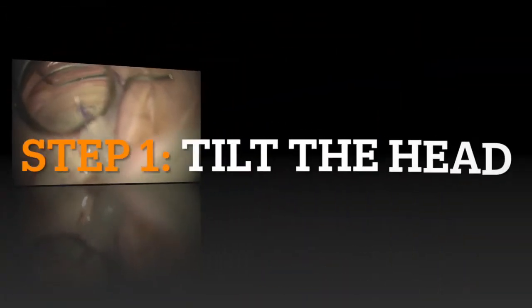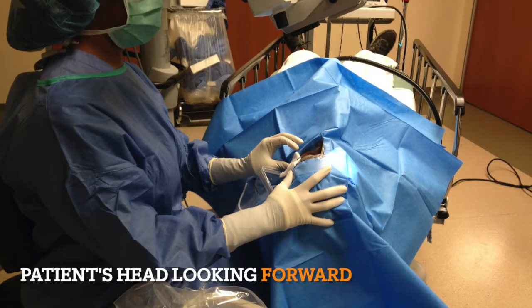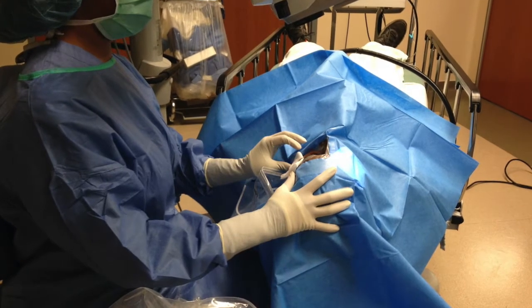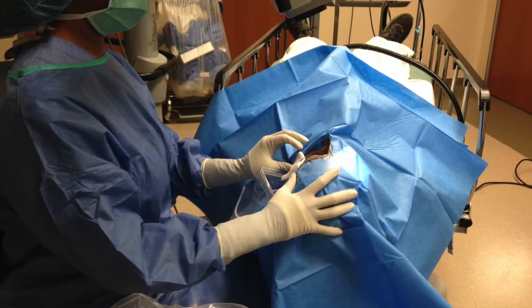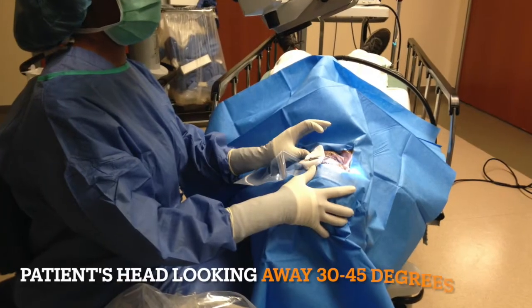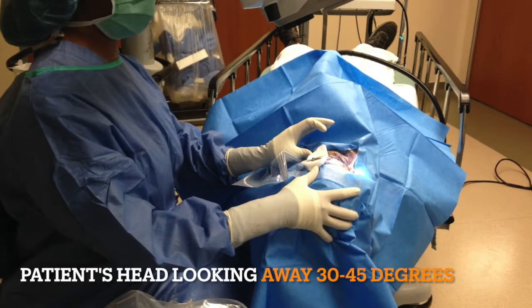The first step is tilting of the head. This may appear to be a simple step, but is very important to obtain a great view. Typically for angle surgery, we sit temporally, so it is good to begin by tilting the patient's head 30 to 45 degrees away from where you will be sitting.